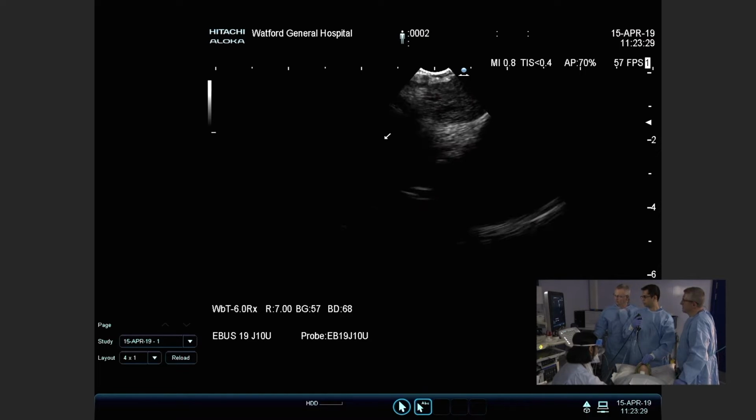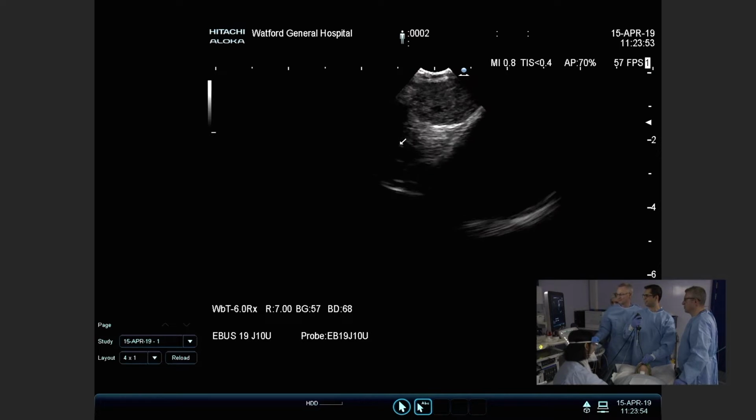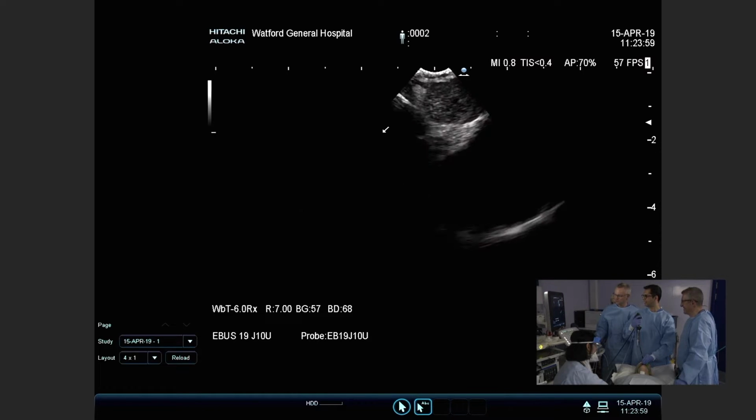If you leave the pointer there, Ray, that's the pulmonary artery. And the other big vascular structure on the right is the aorta. The structure in the centre of the screen at the top is an enlarged lymph node, and we'll come back to the characteristics of that. But that's a 4L lymph node. So this, in my language, is the AP window, otherwise known as the aortopulmonary window. I think for those who read left to right, we should probably call it the PA window, with the pulmonary artery there and the aorta there. And this is your scale here. The scale is down at 20 millimeters. So this is a sizable lymph node.